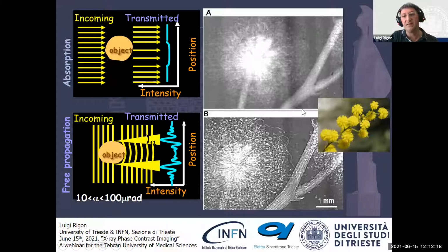You see the difference is maybe at the edges. The edges here are very clearly highlighted by this edge enhancement effect. And this makes sense because we say that the signal is proportional to the Laplacian. So the Laplacian gets big when we have some discontinuities, some interfaces, some edges, right? And so this is the kind of image we could get at the time.